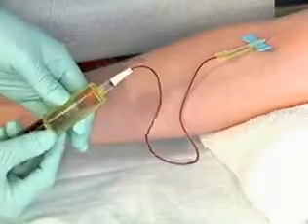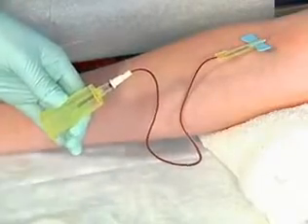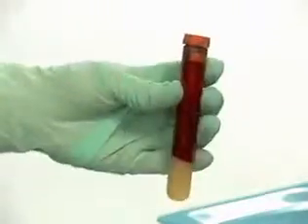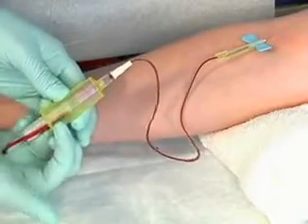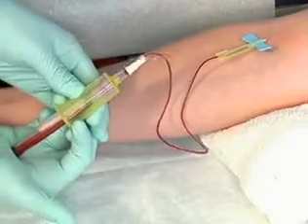Pull the tube off the posterior needle. If the tube contains a clot activator, gently invert the tube back and forth 5 times before laying it down. Insert the last tube into the plastic holder and push it forward to the end of the holder.